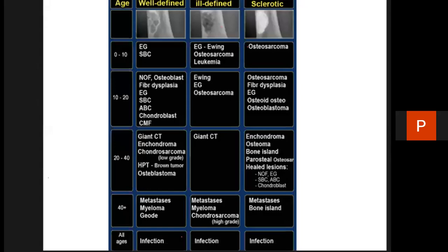Doc, I have a doubt. You showed the picture about the giant cell tumor and aneurysmal bone cyst. Their appearance is almost the same for both tumors, and just the location is different, epiphyseal and metaphyseal. How do we differentiate them if they're given alone?